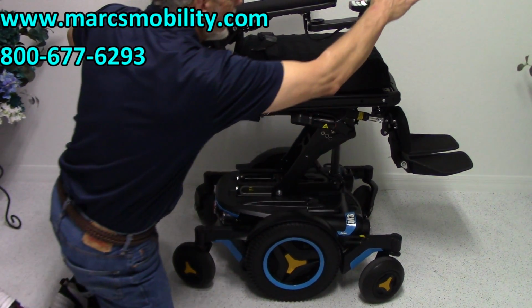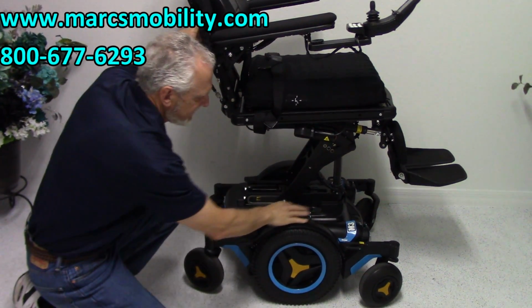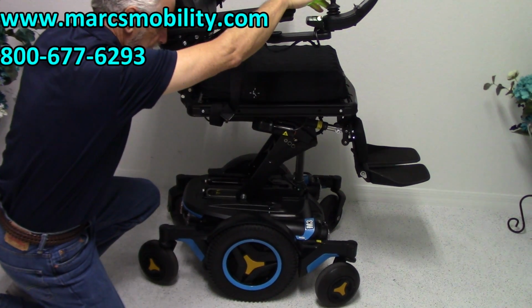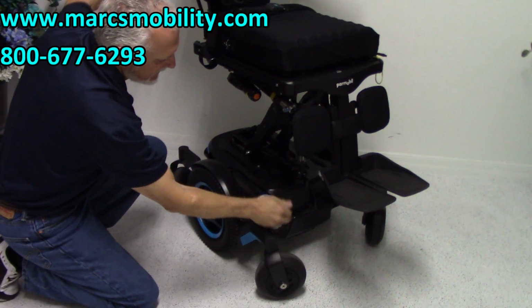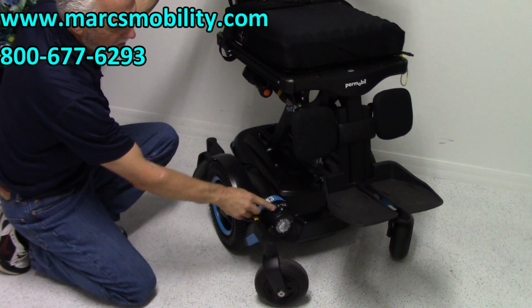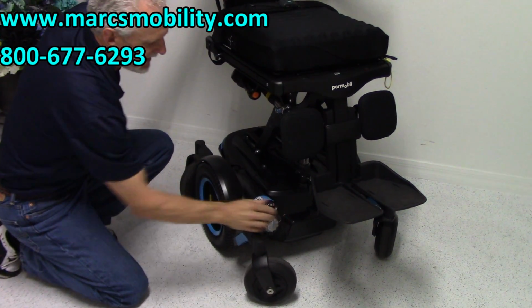So you would make sure the power is off, the seat would be down, and the motors, you can see that the end of the motor is right up front. Let me turn the power back on so you can see the motors. So the motors are right here. You can see these are reflectors at the front of the motors. So if I was to put this chair in neutral, what I have to do, on top of each motor, there's a little lever right here. I would turn the power off, of course, bring the seat down, push the lever inward.